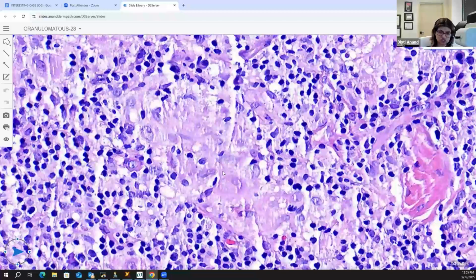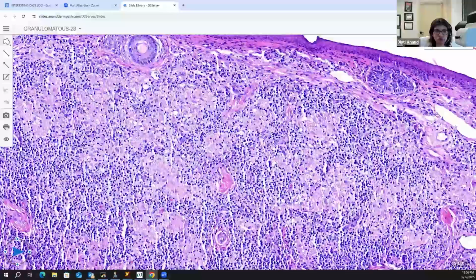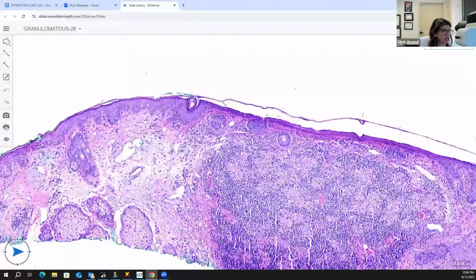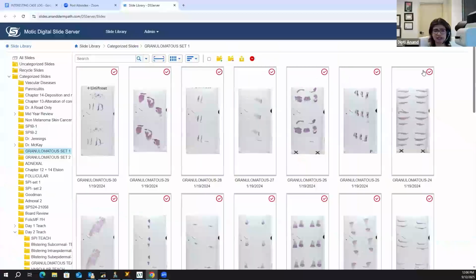And this is the histiocytic nucleus because it's lighter and larger. And floating in its cytoplasm, you see these other cells, the darker cells? And there are plasma cells right adjacent to it. That's like diagnostic of Rosai-Dorfman. And these areas will be S100 positive. Now you see the difference between this and the xanthogranuloma? So that's cutaneous Rosai-Dorfman disease. And these will be S100 positive and CD1a negative.